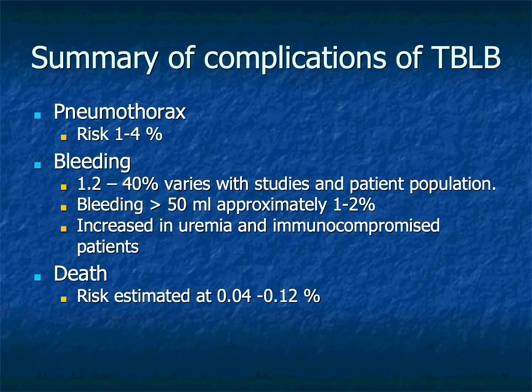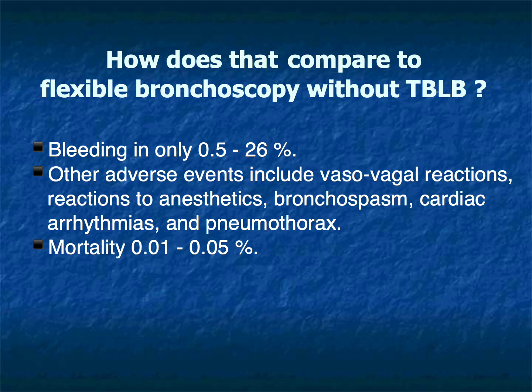These risks emphasize the importance of careful patient selection, correction of visible, reversible bleeding abnormalities whenever possible, and individualized assessment rather than rigid adherence to laboratory thresholds alone. The risks of bronchoscopy with transbronchial biopsy are far greater than when procedures do not include TBLB.